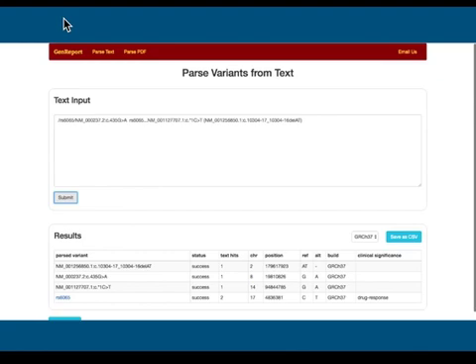And then it has status, just whether we recognize it as a variant or text hits. We give its information against a standard genomic reference. So they're all referenced right now against build 37. And then if we have clinical significance information, we give that as well.